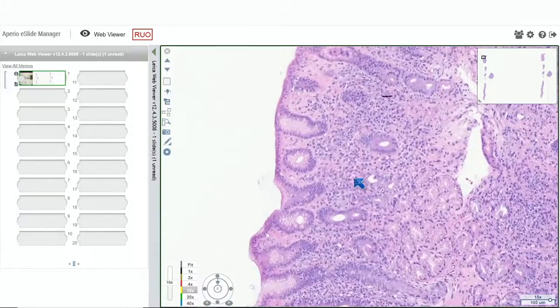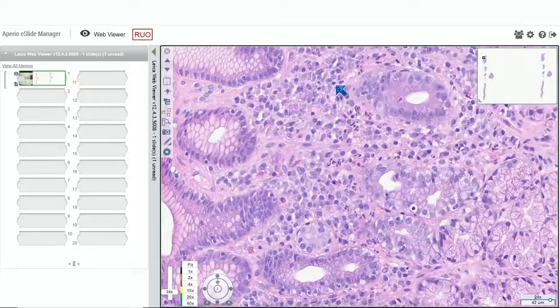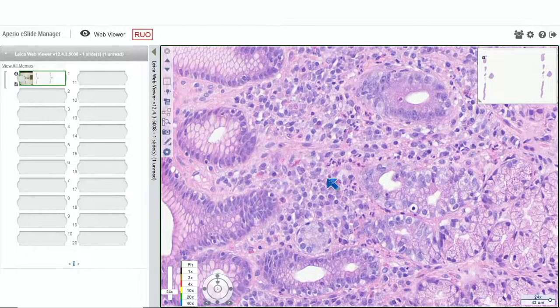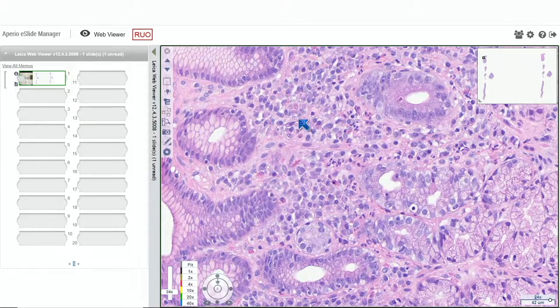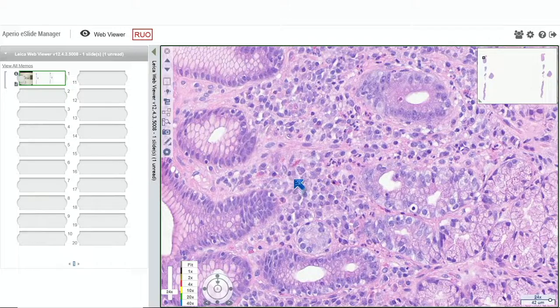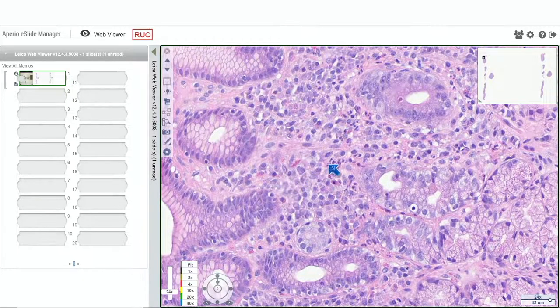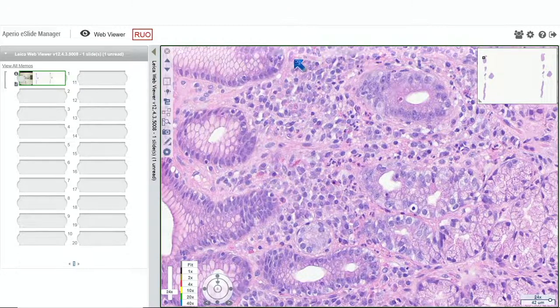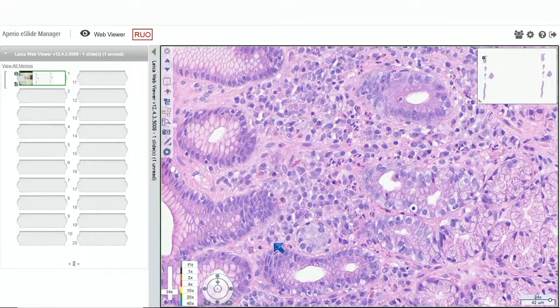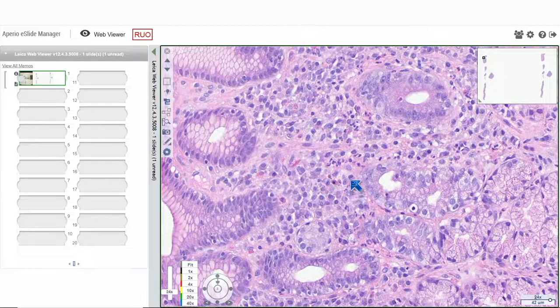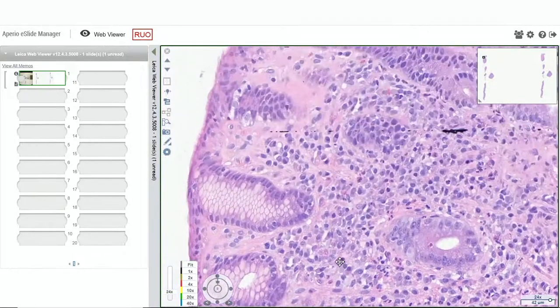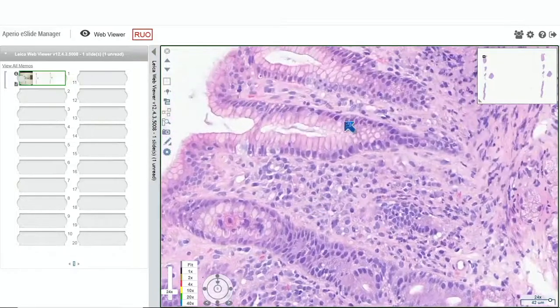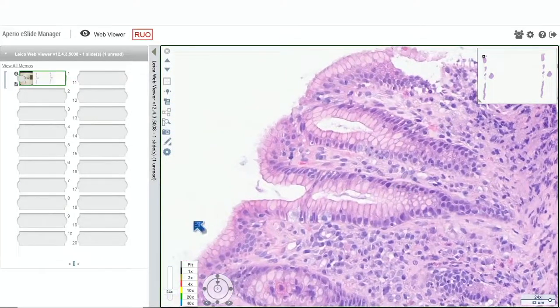If we look a little more closely, we can see that this infiltrate is almost exclusively plasma cells as far as the mononuclear cell component goes. Not much in the way of intraepithelial lymphocytosis, except for a few scattered intraepithelial lymphocytes. Most of the mononuclear cells in the lamina propria are plasma cells, and they're accompanied by neutrophils that are, in some areas, infiltrating the epithelium.